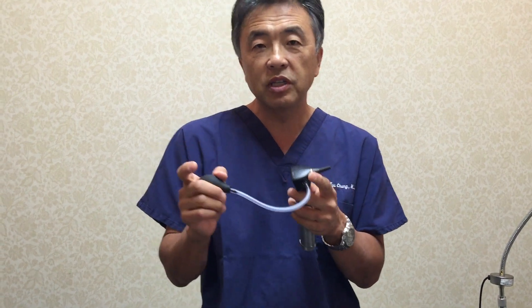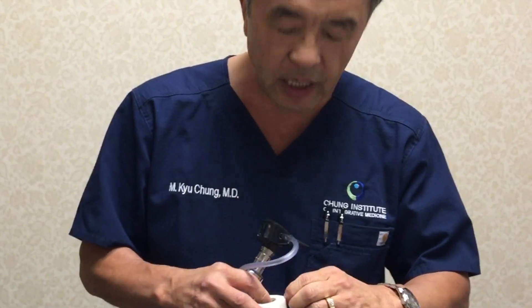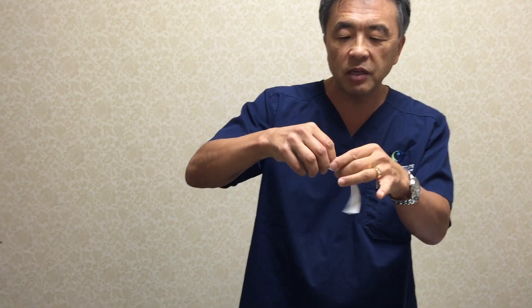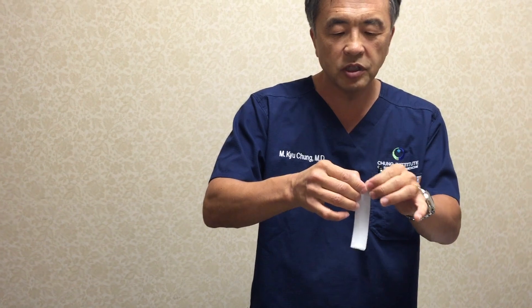The trick, first of all, is to get a good seal. You can buy one of these expensive ones — they cost like $10 to $15 a piece — but the problem with these is that they're still a one-size-fits-all. If the ear canal is wider than this, you will not make a good seal. You can make a seal using a simple adhesive tape that you find. Preferably tape that's not paper, but paper will work also — it's just not quite as good.